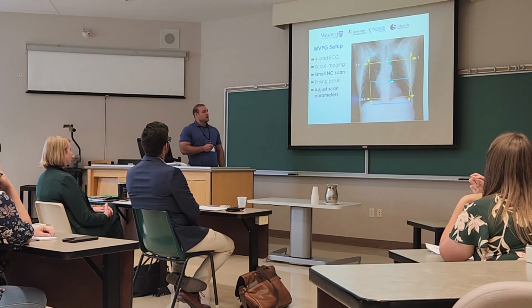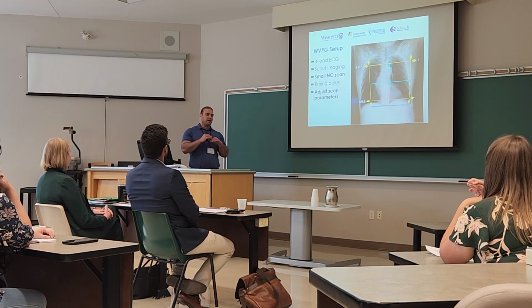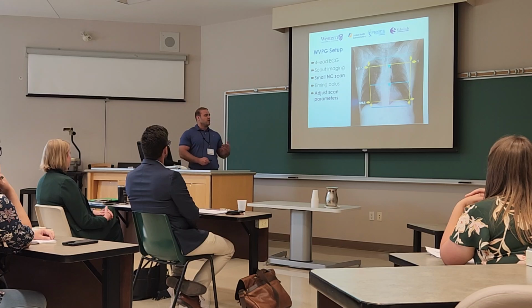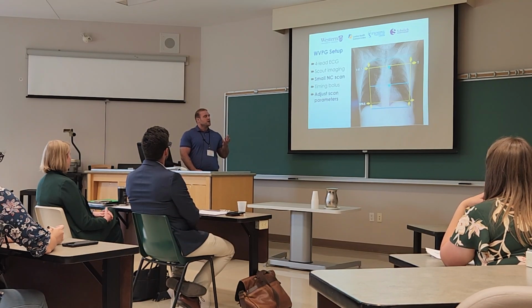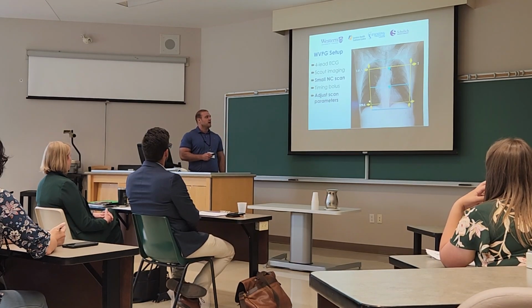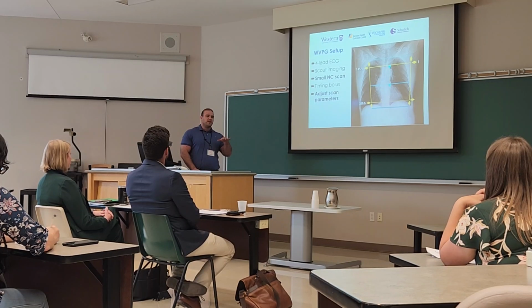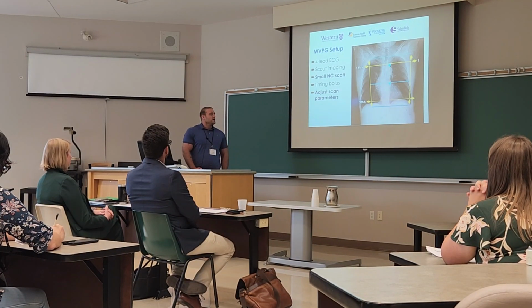This middle blue line here represents the area in which the 2 volume scans overlap, and that's where we get that slab artifact. So it's very important for us as techs to ensure that we get this bottom blue line here as high up as possible, so that we get as much of the heart inside as a bottom volume scan, so that slab artifact doesn't really limit the radiologist's ability to make a diagnostic assessment of the heart.